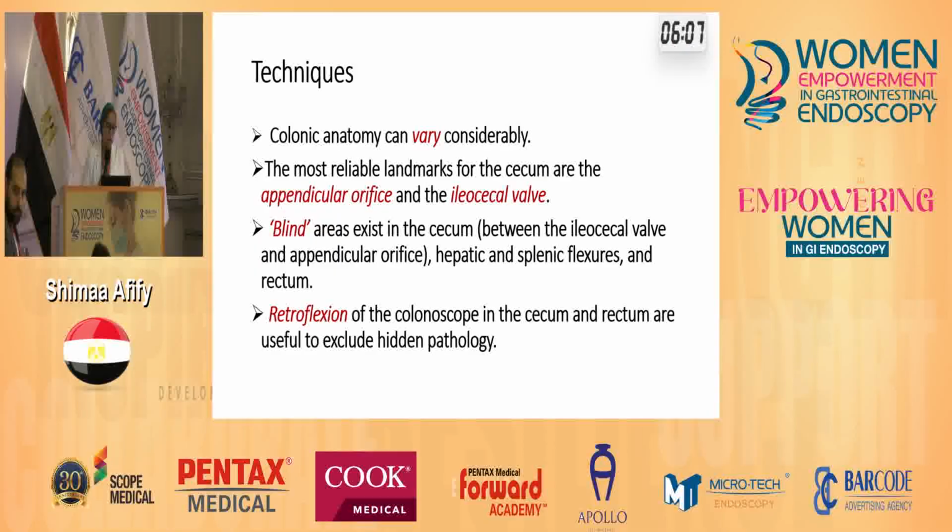And don't forget that blind areas exist all over the colon, especially at the cecum between the ileocecal valve and the appendicular orifice, the hepatic and the splenic flexures, and also in the rectum. Even some professionals can perform retroflexion in the cecum or in some parts of the colon, but only professionals can do it. Don't try it yourself as a beginner. Retroflexion of the colonoscope in the cecum and rectum is useful to exclude hidden pathology.